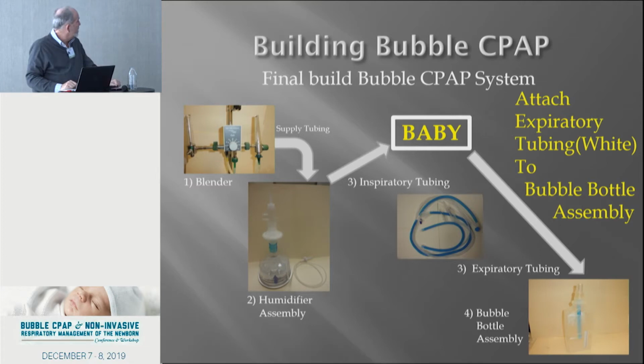Straightforward. In the very, very beginning, so that my therapist would grasp that, we actually put a manometer on for a short period of time, and then the manometer did this. 4, 6, 4, 6, with each bubble release, 4, 6, 4, 6. We agreed that that was 5, okay?